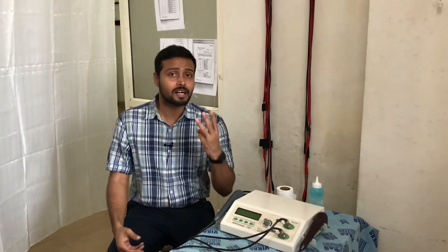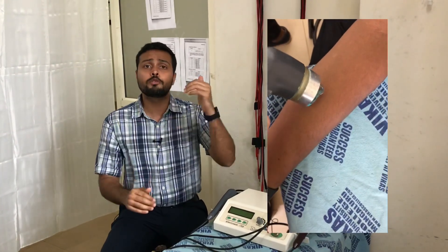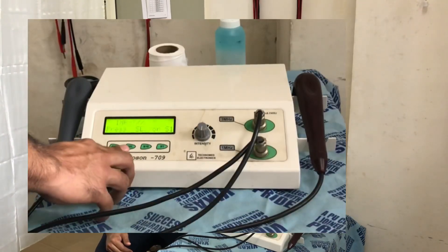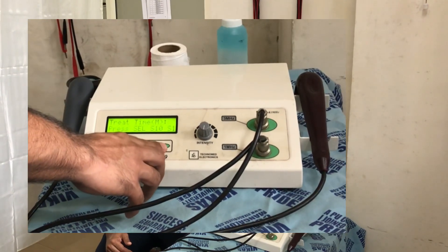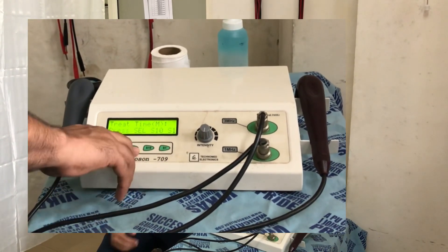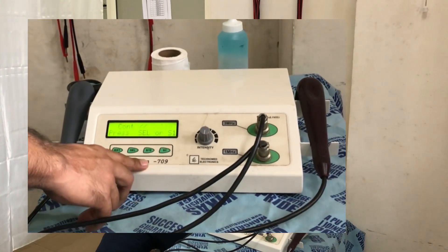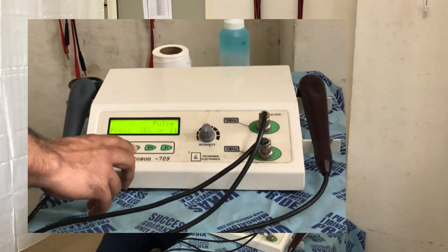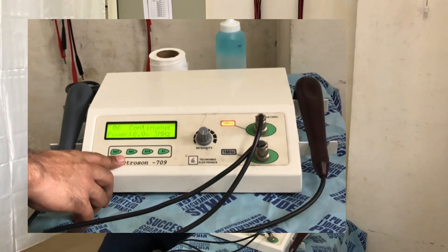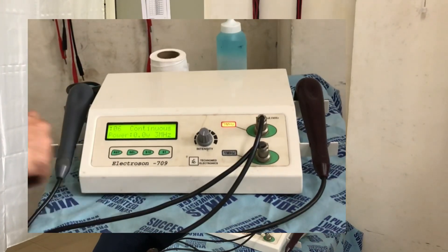Three megahertz is normally used for superficial heating and superficial area treatment. Whenever you need to penetrate ultrasonic waves up to one or two centimeters, the intensity should also be kept low — around 0.5 to 0.75 — since it is a heating modality and can produce heat inside the tissues. The exact intensity depends on whether you are using pulsed or continuous mode.